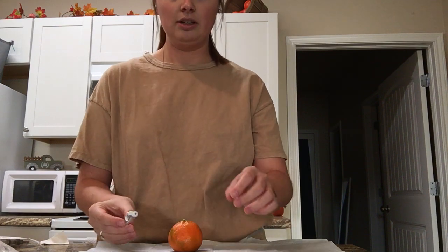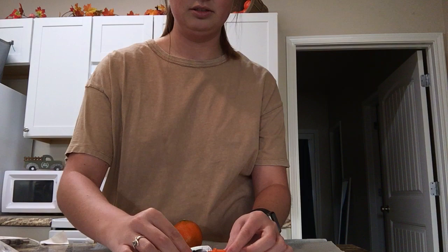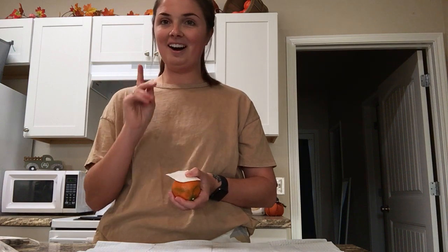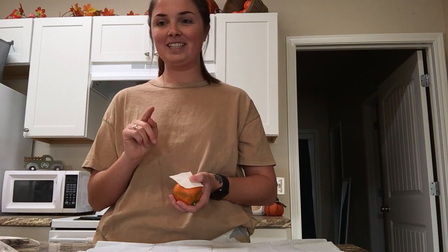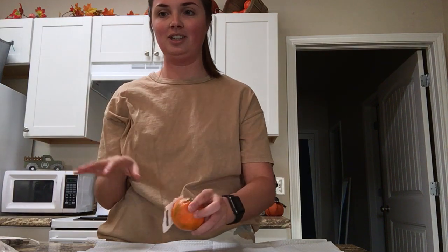I'm going to put the cap back on. And then I'm going to hold a cotton ball on there. Also, I would have cleaned the patient's skin for 20 to 30 seconds with an alcohol wipe before I gave the drug. I think that's all.